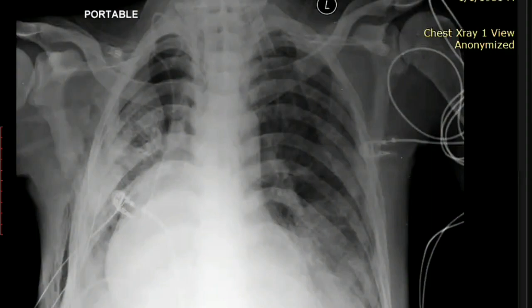Madam, please tell the diagnosis of this case and also the location of the tracheostomy, ETT. They are asking. Okay, so I will be honest, seriously, I don't remember the diagnosis, but definitely this was a metastatic lesion. But what was the primary? I don't remember. I think it was some osteosarcoma or something, and that has resulted in pneumothorax, with other metastatic lesions. That is what I can recall from my memory, but I don't know the exact words in the diagnosis.